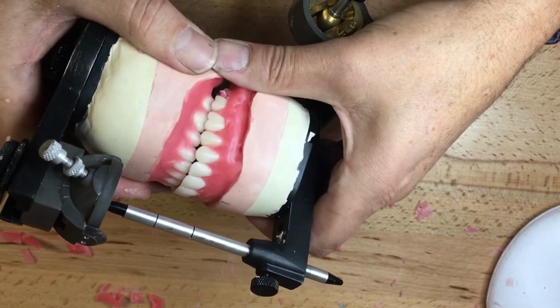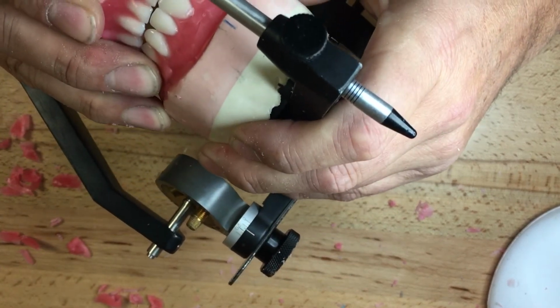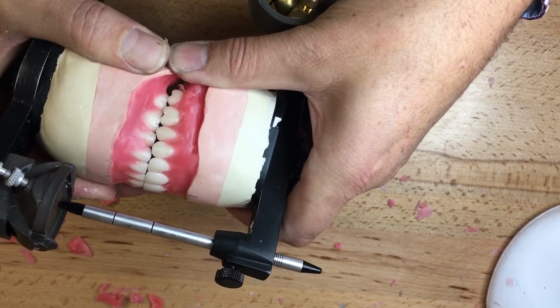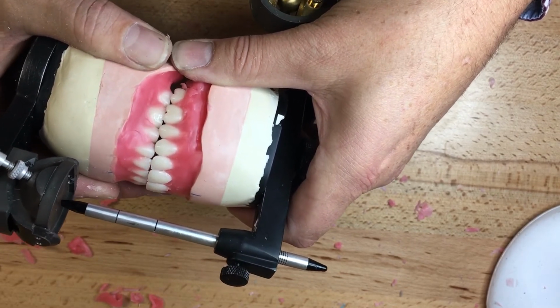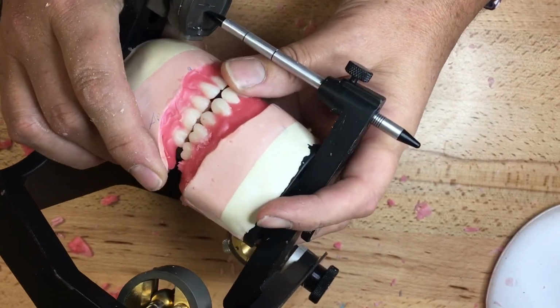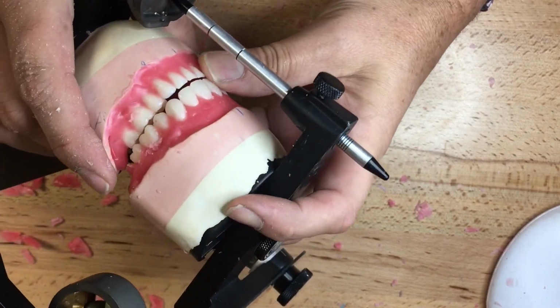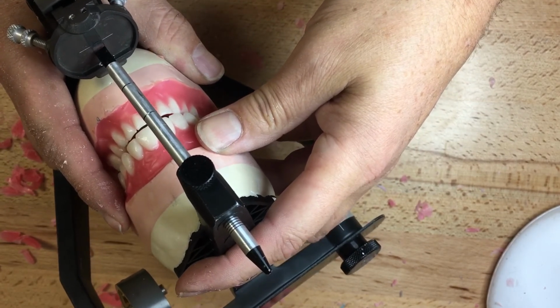Lingualized occlusion, balancing contacts with anterior just kissing and missing, protrusive contacts, smooth transition between anterior. If I have any eccentric contacts, I can eliminate them with the handpiece, but I'll probably wait chairside to eliminate any eccentric contacts. On this side, protrusive movements, balancing contacts, and anterior protrusive contact simultaneous as the posterior contact. Just slightly on this side.